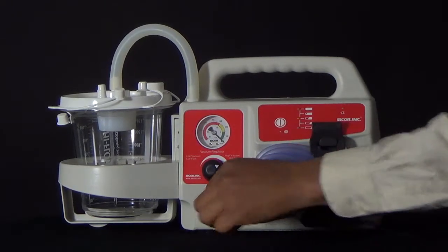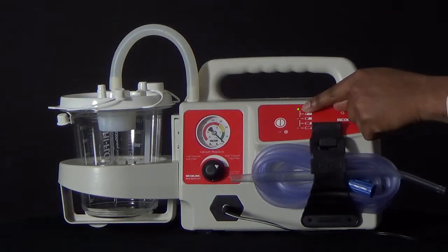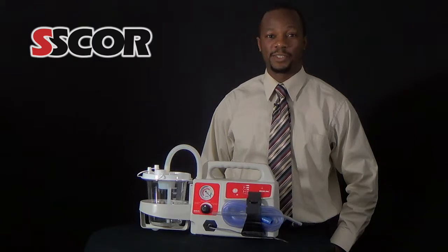The first step is to plug the aspirator into charge and charge it until the indicator on the pump or on the charger indicates that the charge is full. If your pump or charger does not have a charge indicator, charge the battery overnight to ensure it is fully charged.